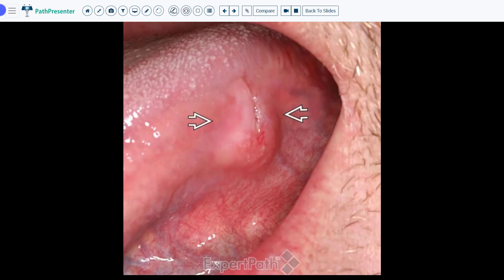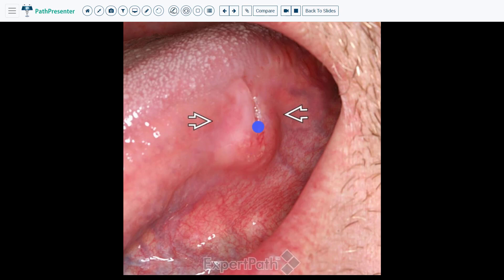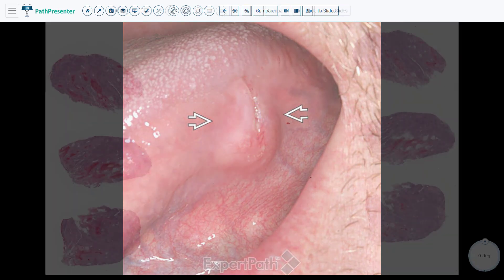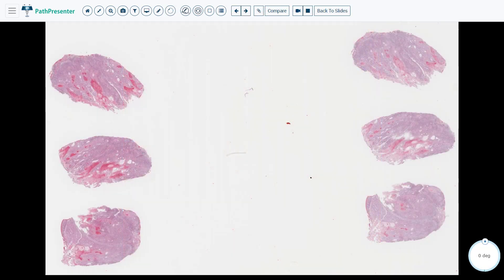Case one is oral squamous cell carcinoma. You can see in this picture the top of the tongue is up here, this is the edge of the mouth, and there is obviously a tumor right here. This lesion from here to here is an ulcer on top of the tumor. This is a biopsy of the tumor — you can see there are three pieces of tissue. I'm going to take a closer look at the one on the bottom left.